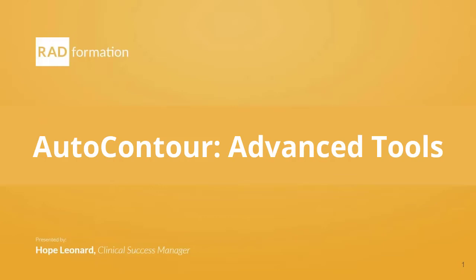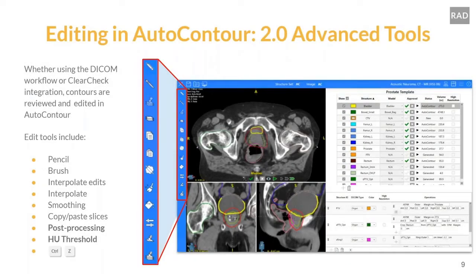Version 2.0 came with some new advanced tools. With our pencil we now have a rubber band function. Our brush has an adaptive tool for post-processing. We also have a cleanup and fill tool, the HU threshold tool to narrow down contours, and Ctrl+Z so you never have to worry about mistakes — you can go back to your history and always retrieve prior contours.